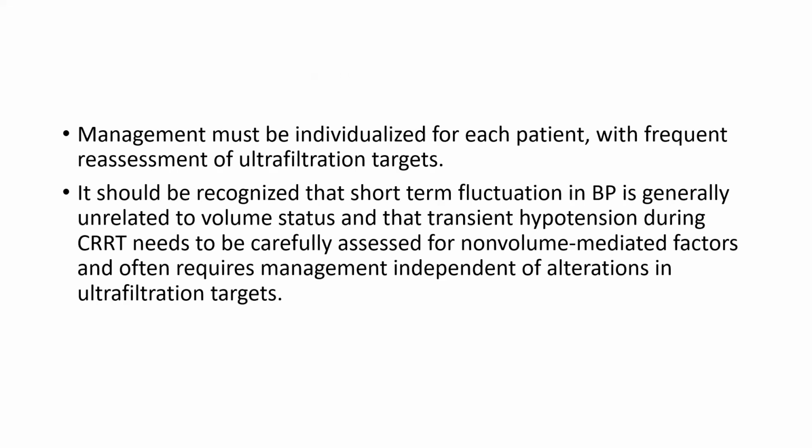Management must be individualized for each patient with frequent assessment of the ultrafiltration rate. It should be recognized that short-term fluctuations in BP are generally unrelated to the volume status, and that transient hypotension during CRRT needs to be carefully assessed for non-volume mediated factors and often requires management independent of alterations in the ultrafiltration rate.